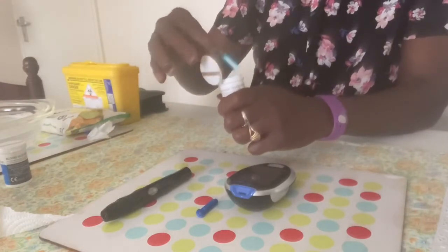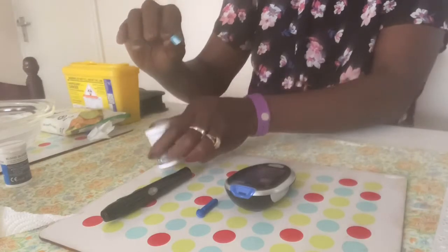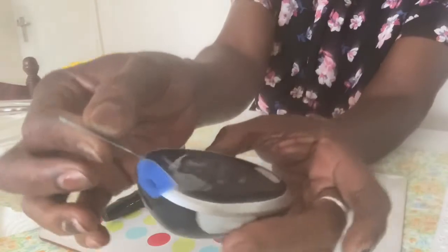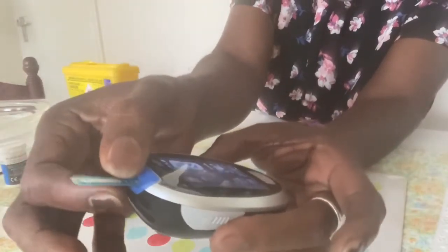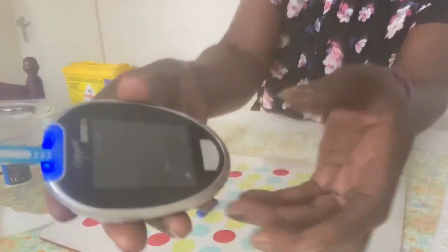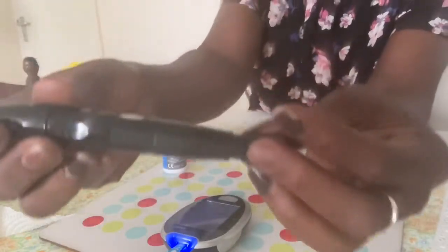The second step is to take a test strip and slot it into the meter to turn it on. Some meters will have test strips built in.